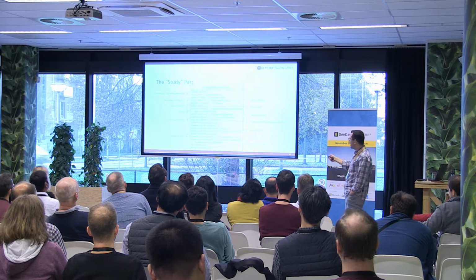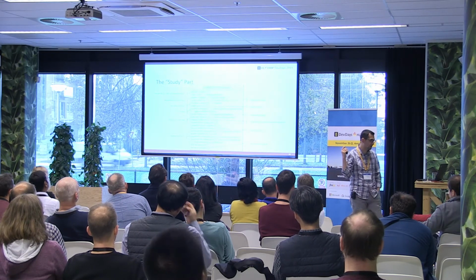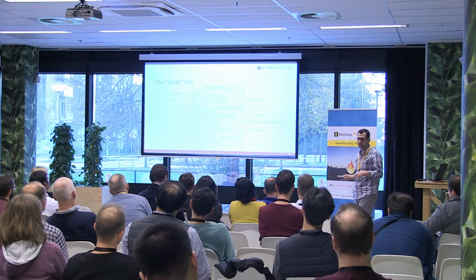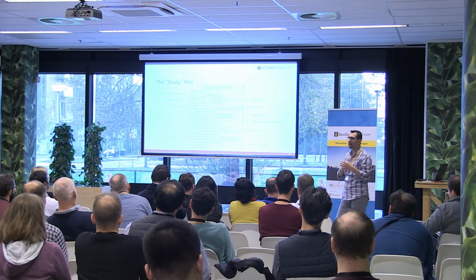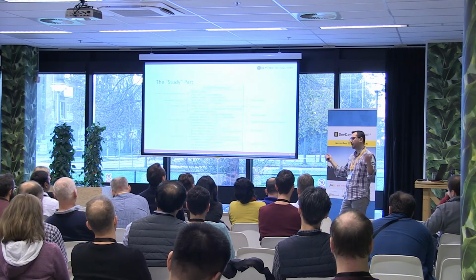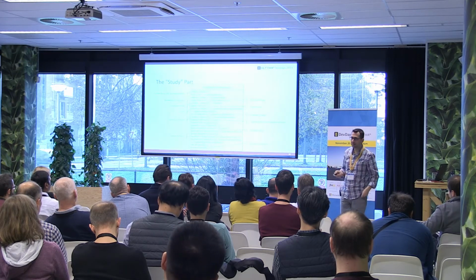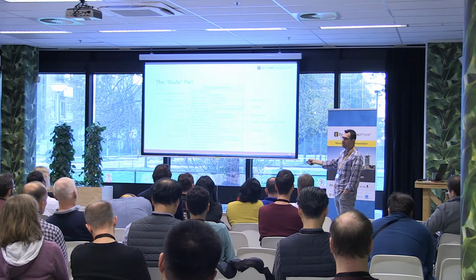Endpoint tells you where you can actually go get that study from or get more information about it. We'll talk about that in more detail in just a moment. Procedure type, and then of course there's always a description, so just miscellaneous information. Usually the description in real life describes what the procedure looks like. It would be something like CT scan without contrast, for example. Things that clinicians understand, tech people don't necessarily fully understand what they mean. So we're generally better off talking about procedure code just to be sure here.